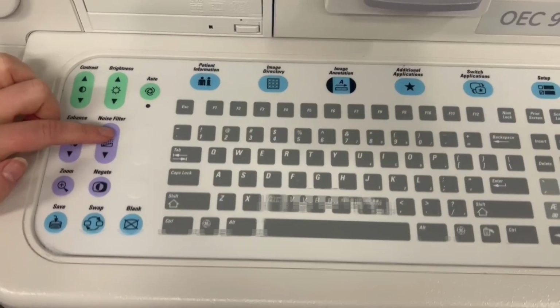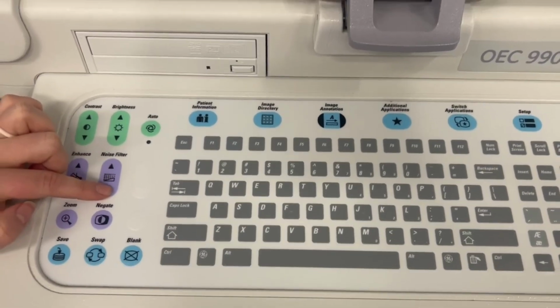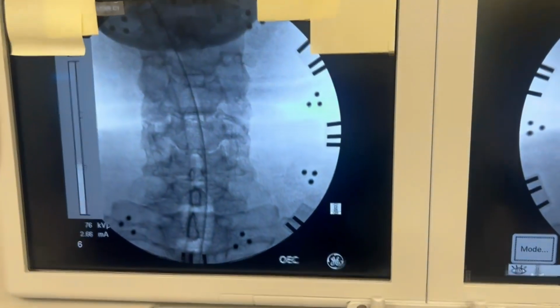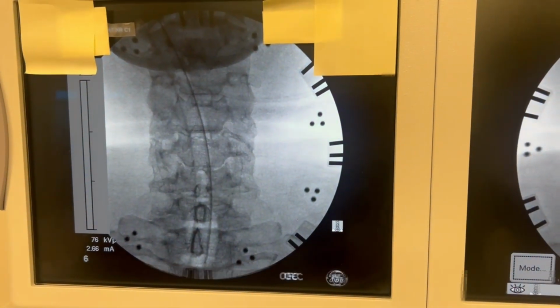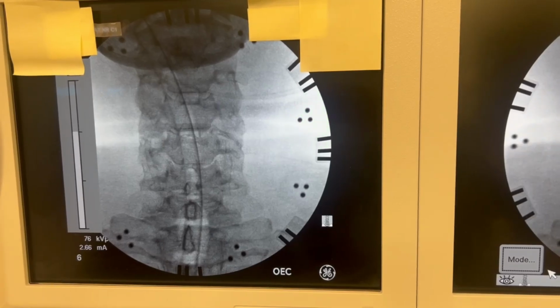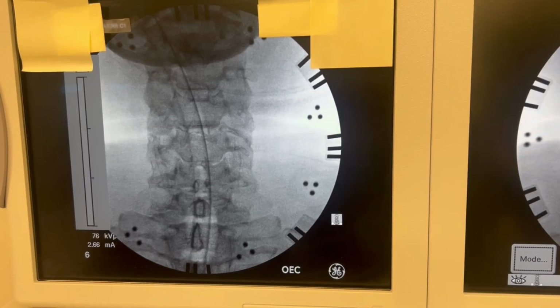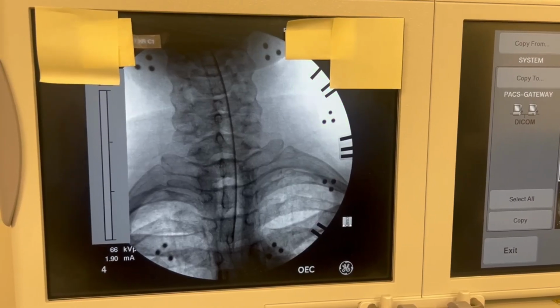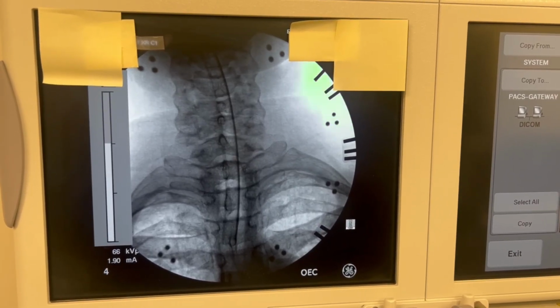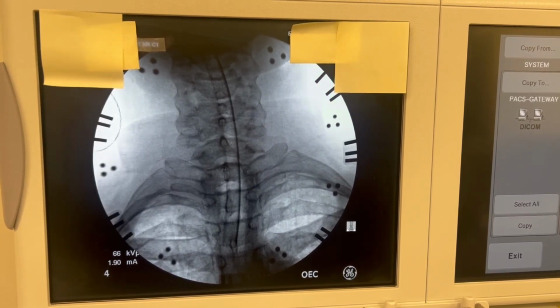The noise filter is used to reduce blur in the image when motion is present and cannot be stopped. The noise filter creates a great quality image, but if motion is present, it does add blur to the image. There are 3 options for the noise filter. Noise filter 3 creates the sharpest image with the least amount of noise when there is not any motion present. Noise filter number 1 produces the least sharp image with noise, but if motion is present, it is able to create an image that is optimal.